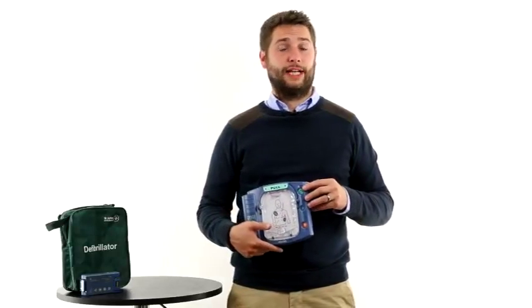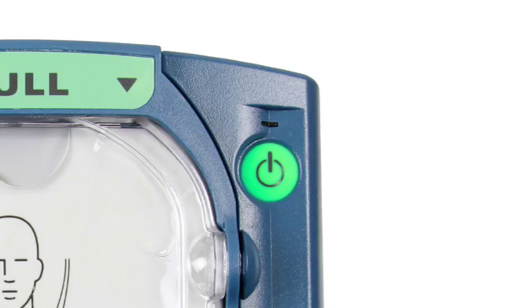The defib also has a self test function, carrying out self diagnostics and indicating its readiness via a green flashing LED.